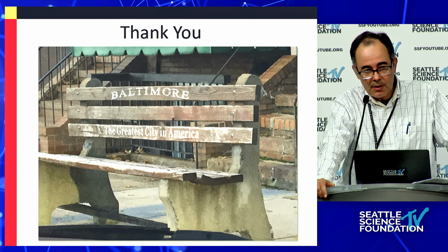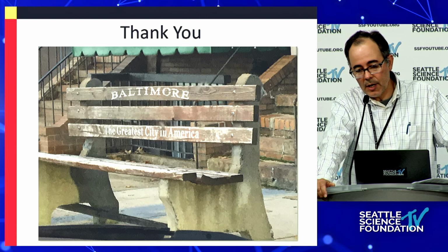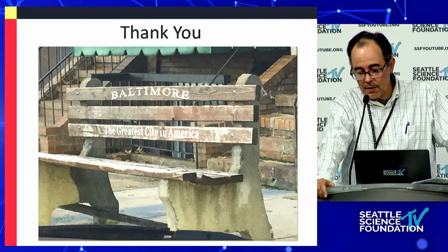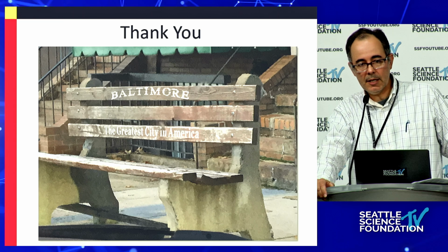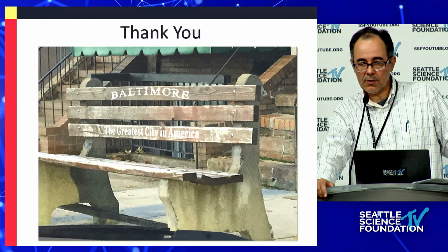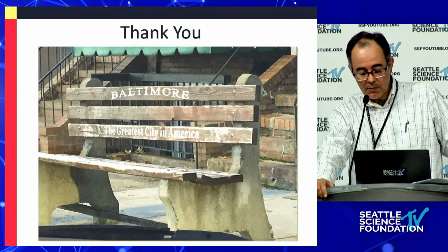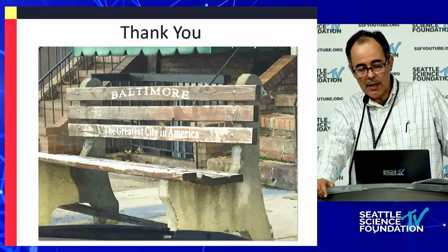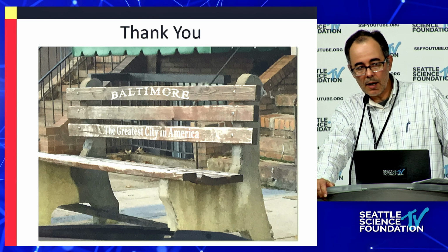So I think fusion is easier on the surgeon. Unfortunately, it's not easier on the patient. So it's one of those dilemmas that we have. It's more of a guarantee in terms of good outcome. But you really have to be very careful with your arthroplasty patients to do a very thorough decompression if you're going to have success. And again, I put those videos of the foraminotomy because I think it's an underutilized procedure. If the patient has unilateral symptoms, one should consider a foraminotomy.